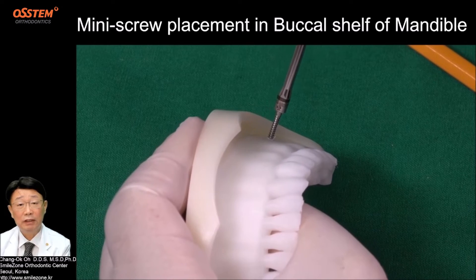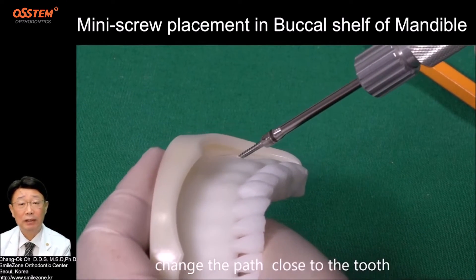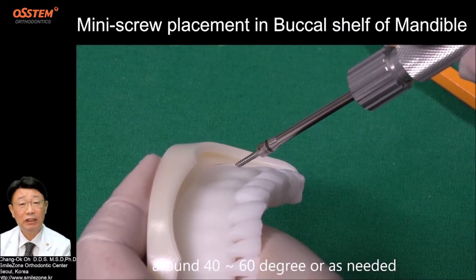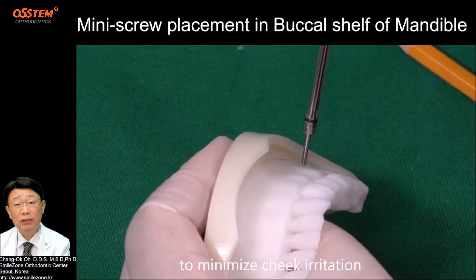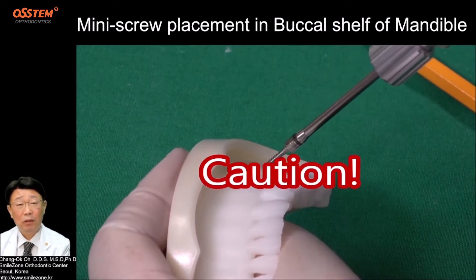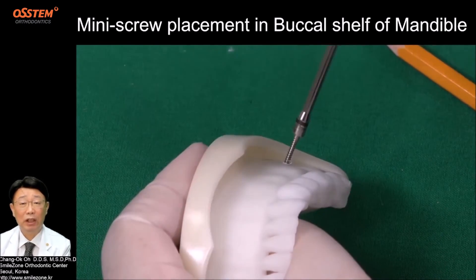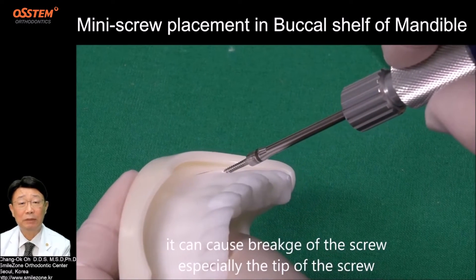Step 4: Set the final path. After pulling back, change the path close to the teeth, around 40 to 60 degrees or as needed. To minimize cheek irritation — caution: do not change the path while turning the driver. It can cause breakage of the screw, especially the tip of the screw.